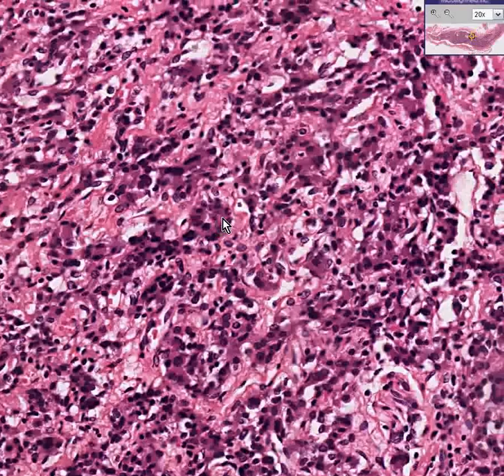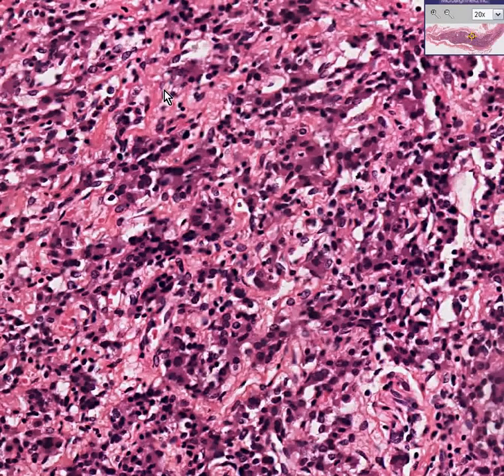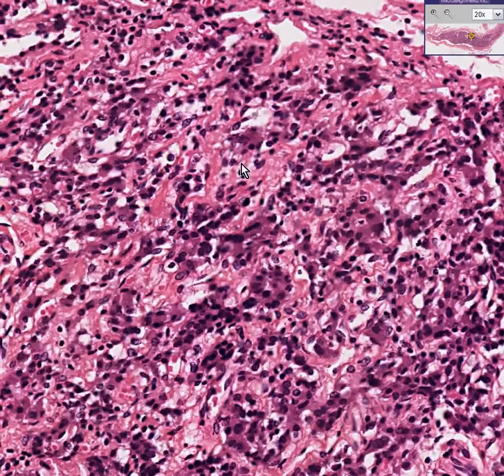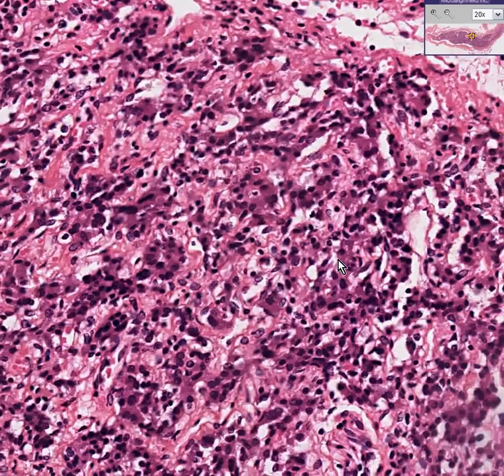In addition, there is a really tremendous amount of infiltration around these primitive glandular structures of chronic inflammatory cells — lymphocytes. It's almost as though the body was attacking its own adrenal cortex.